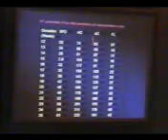Here is the 10th percentile for 4 fetal parameters, all parameters in mm. There is difference. If we go in detail, we can see that there is difference from the international data. But if we compare it with the Indian data, there is a little bit difference in few parameters.